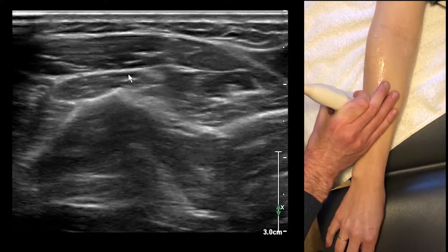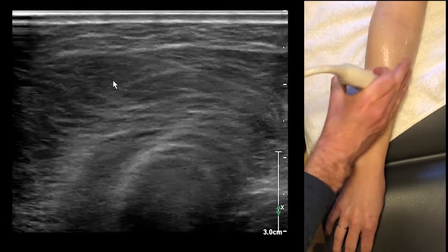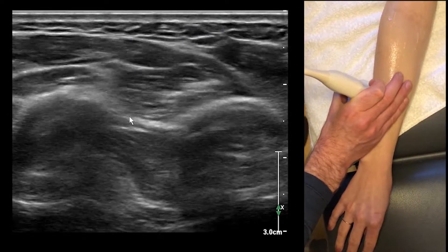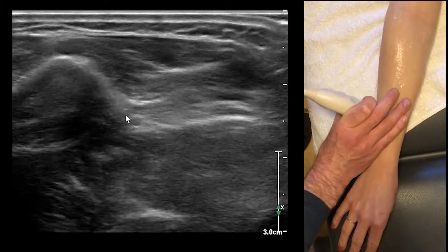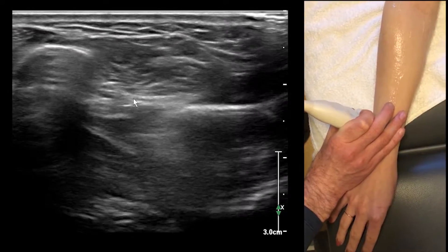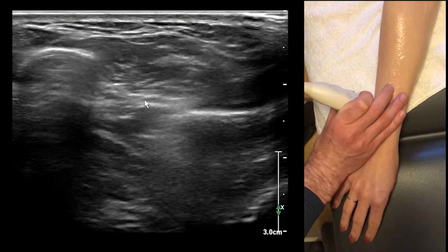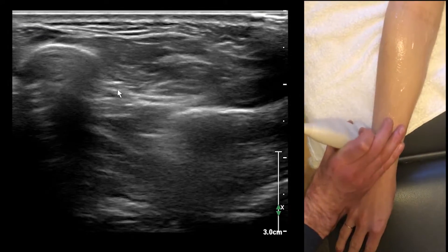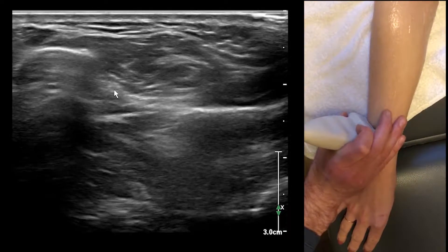The posterior interosseous nerve, just like the anterior interosseous nerve, eventually ends up on the interosseous membrane. You can follow it down on the interosseous membrane — your localizing landmark here is going to be the artery that follows with it. So these little fascicles here — if you're going to do a nerve block, you can just do it right on this membrane as well.